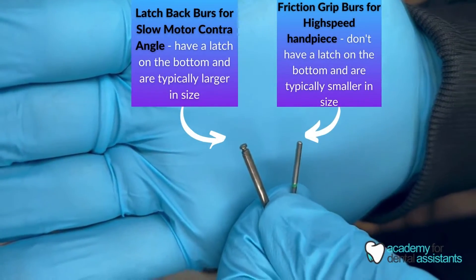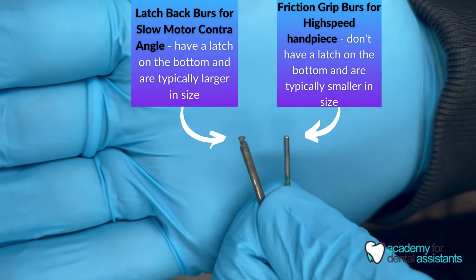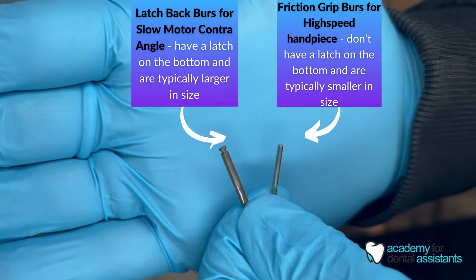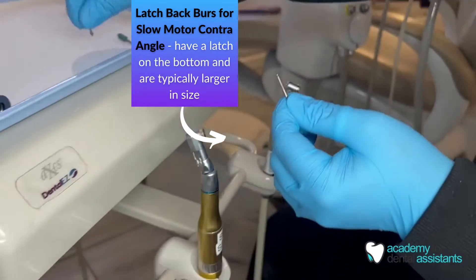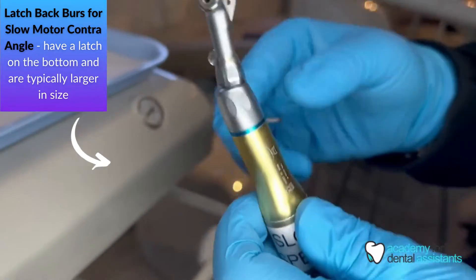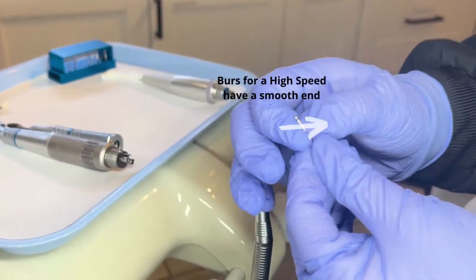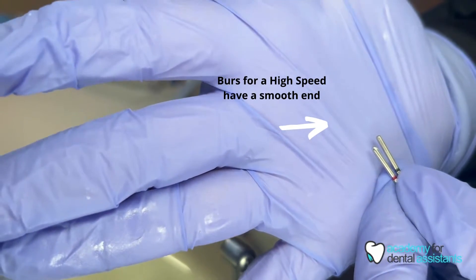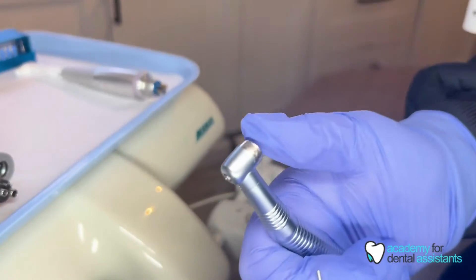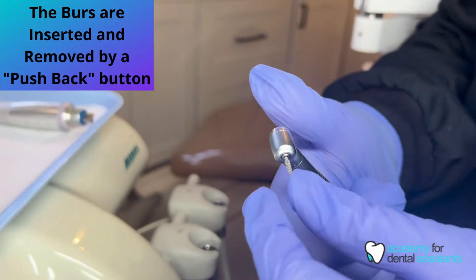There are different types of burrs. One that goes in the high-speed handpiece is usually a friction grip burr that is smooth at the end, as you can see on the right. The other type of burr is for the slow motor contra angle — a latch-back burr that has a groove at the bottom so it can fit into the latch and lock in place. For the high-speed handpiece we use a friction grip burr with smooth ends. The doctor will have a preference of which burr to use — different burrs such as 557s and 330s — so it will just be your doctor's preference.